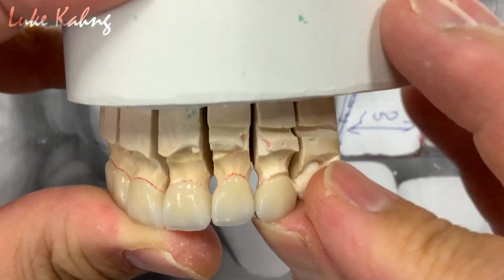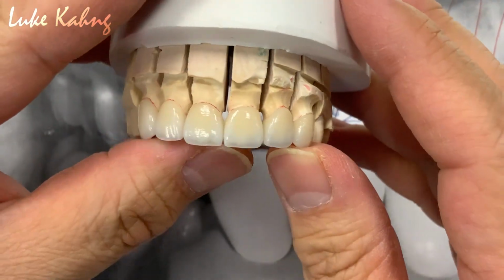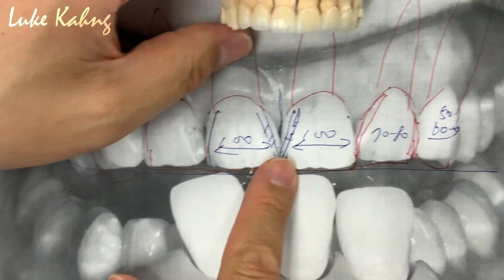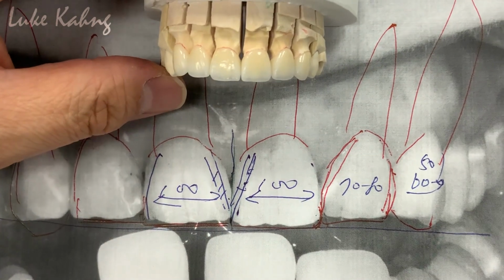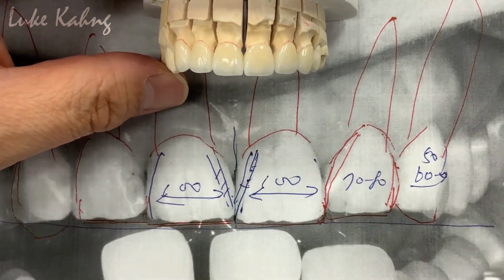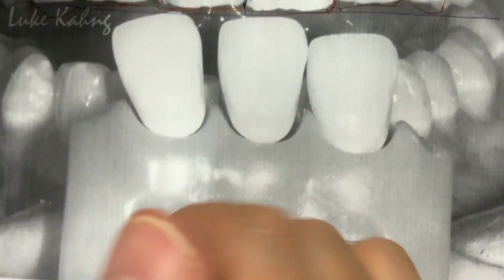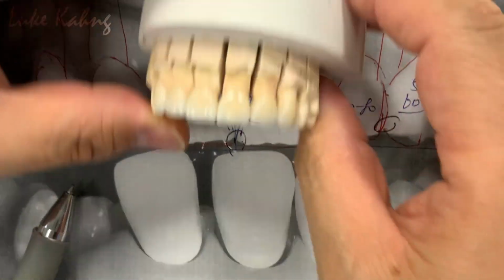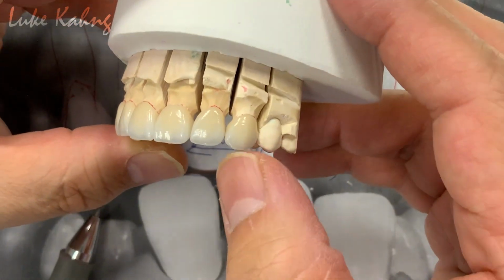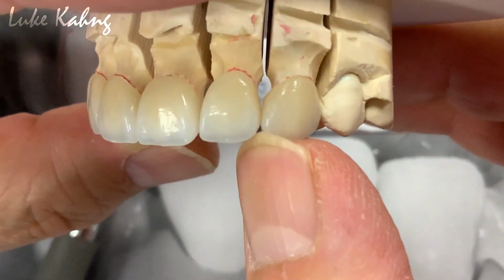And not only that, we match the shape and contours that I presented. So this is the long axis. And then an open incisor embrasure. I did not mention incisor embrasure too. So we can mention incisor embrasure here, there, which is another key factor to make this better aesthetics, individualized aesthetics as much as possible.